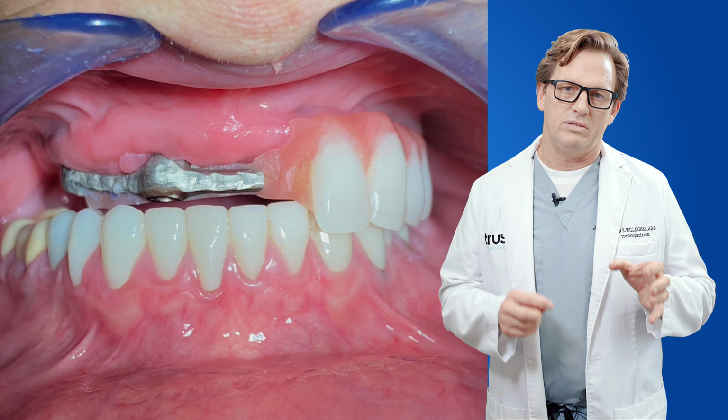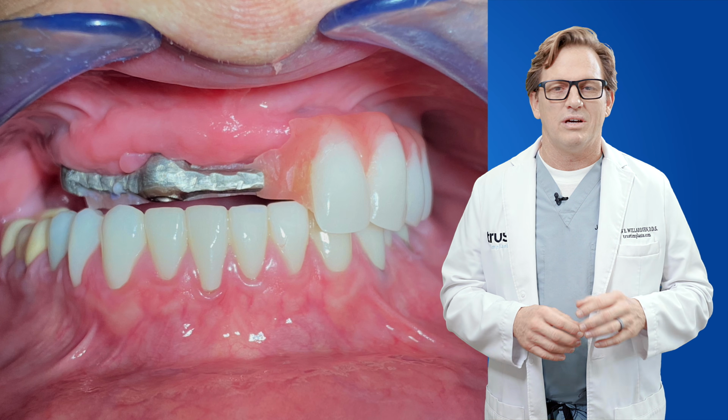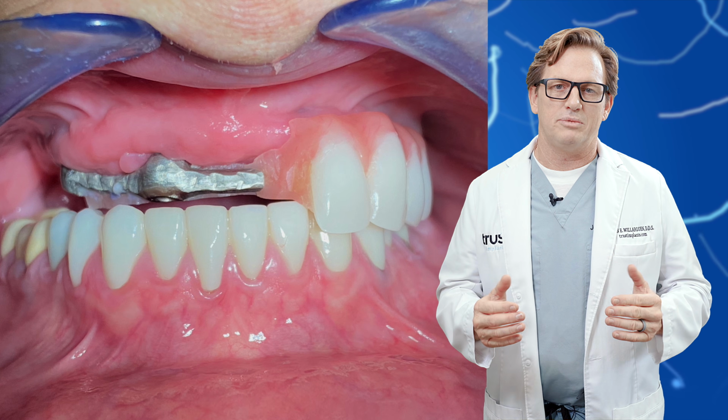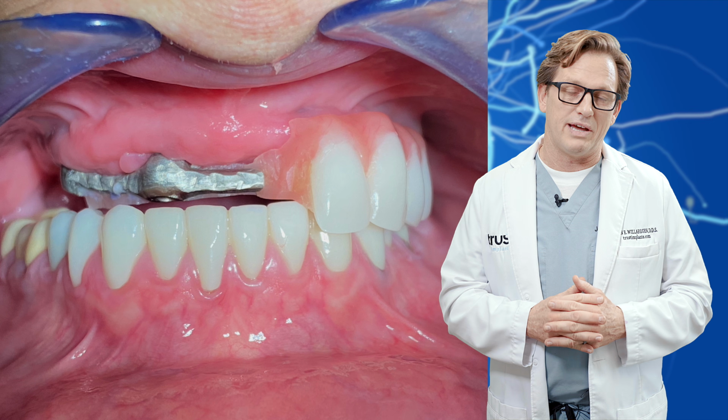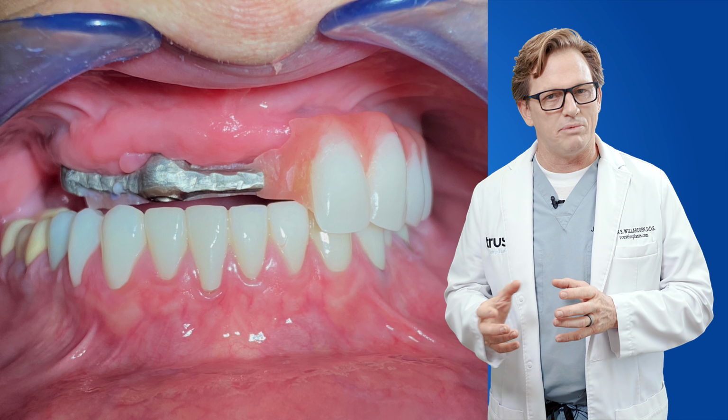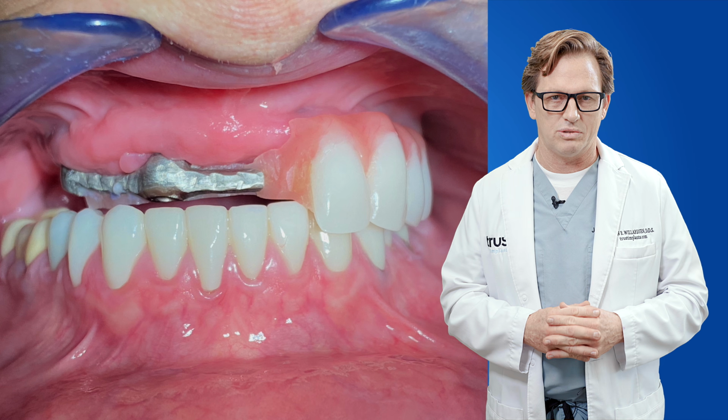So let's take a look at this patient here, who had this work done at a previous office, and about a year later, everything started to fall apart. And this is why I am so adamant: if you're having this procedure done, all-on-4 is really not for anybody. It's a procedure that was developed to simplify the surgical process without really thinking about the prosthetic or the biomechanics of how the mouth is supposed to work.